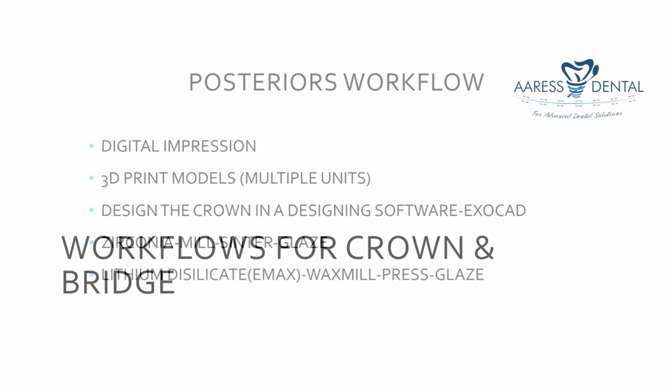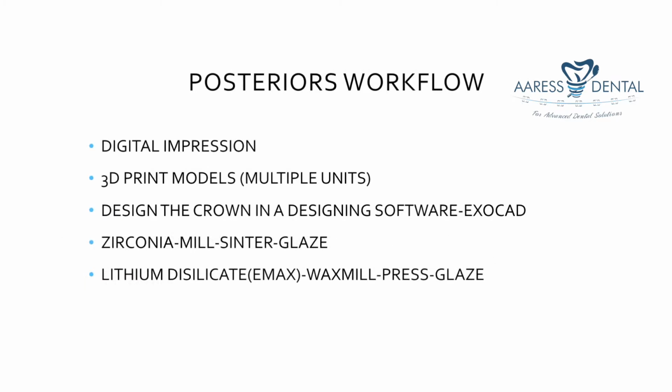Now I am going to show you the workflows for crown and bridge. First, we start the workflow for posterior crown and bridges. Once we acquire the data, that is, once we take the digital impression, we print 3D models. Then we take the digital impression to the CAD software where we design the crown.